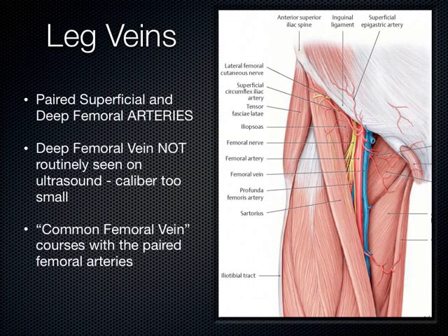So in terms of the leg veins, I know you haven't had this anatomy yet, but this was the only time we could get in to do this lecture. Essentially, you've got that in the inguinal area up there, sometimes called the inguinal canal, right along here. This is the inguinal ligament going along here, okay? You can see some muscle bellies here. But this orientation of the nerve here, and then the femoral nerve, and then the femoral artery, and then the femoral vein is seen medially to it.